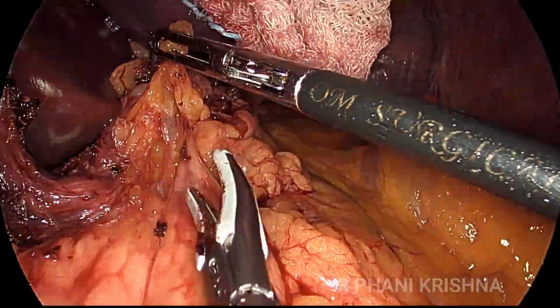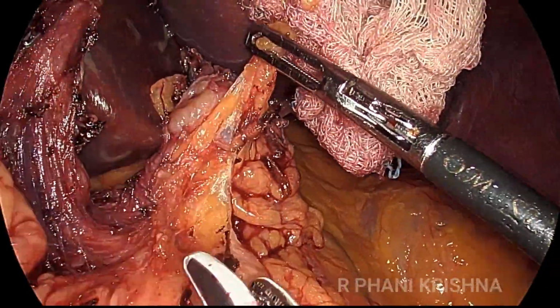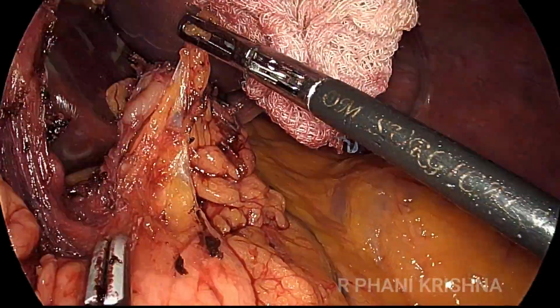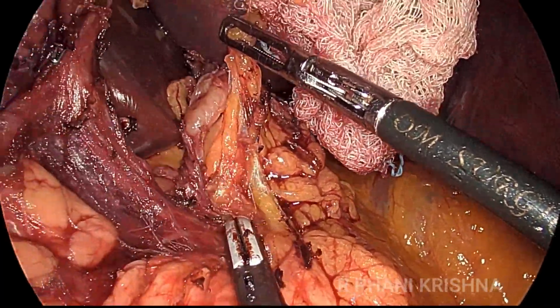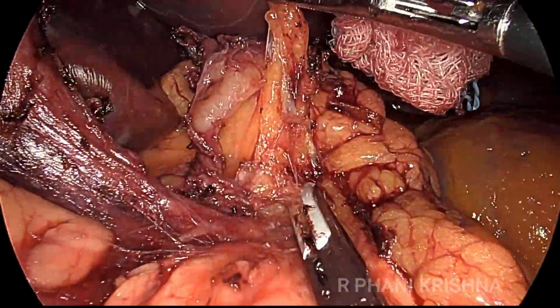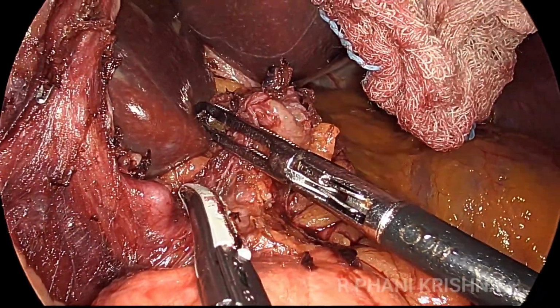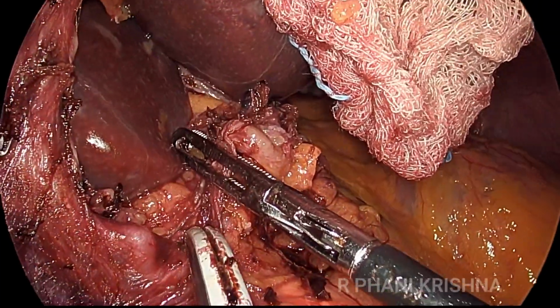Now we are at the celiac origin. We use the left gastric as a marker there. The lymph nodes of the common hepatic, the right side of the celiac origin and the common hepatic lymph nodes are all being cleared here.